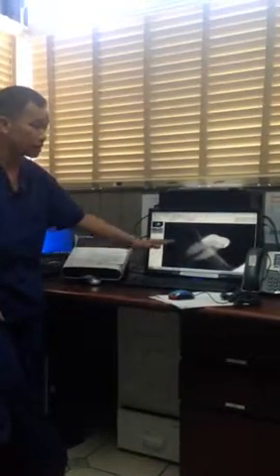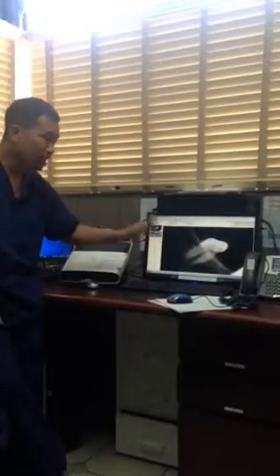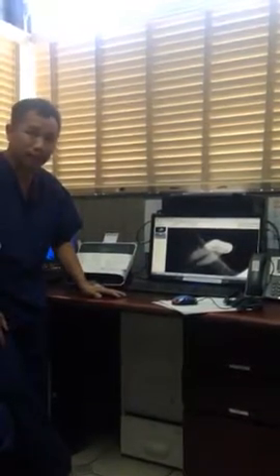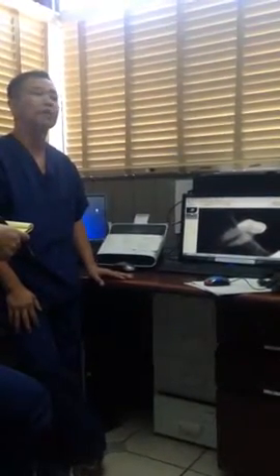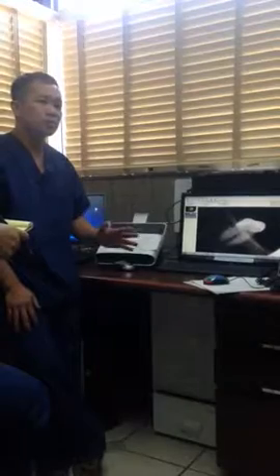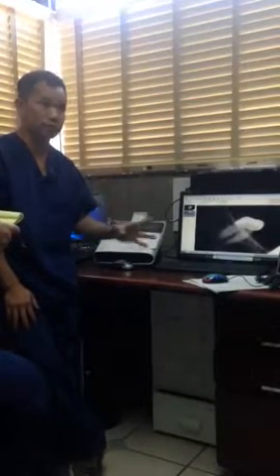However, the patient says, "This tooth hurts, doctor. I can't touch it. I can't put my tongue on it. I can't chew on that side. It's been hurting since last night. It's been giving me problems 2 or 3 weeks ago, and then now, last night, it went berserk."